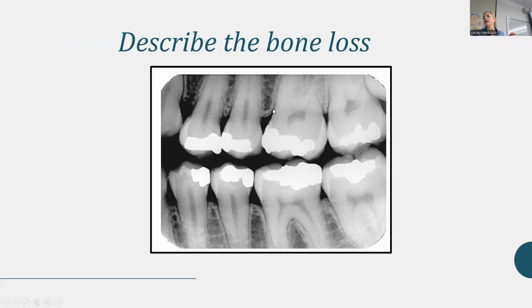From here to down in here. Are you looking at this little section through here? That could be clenching and grinding. I don't have any bone loss, but I do have some widened PDL.